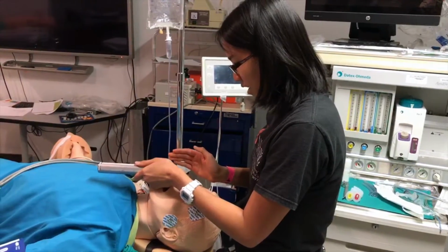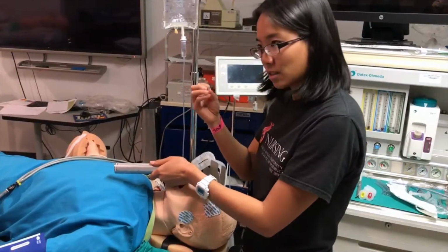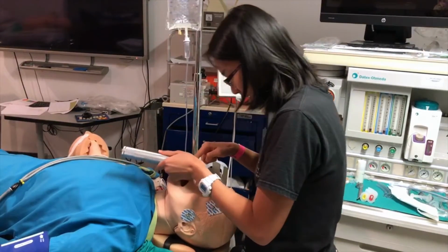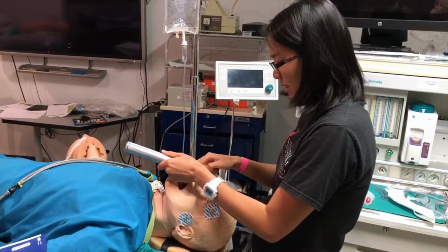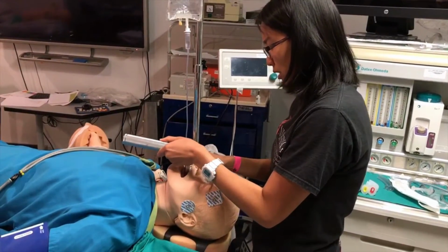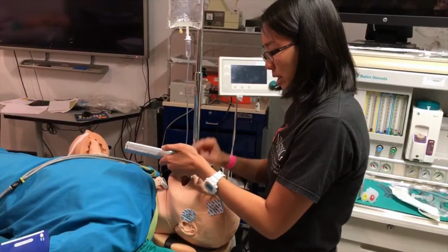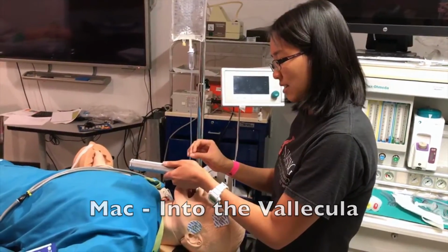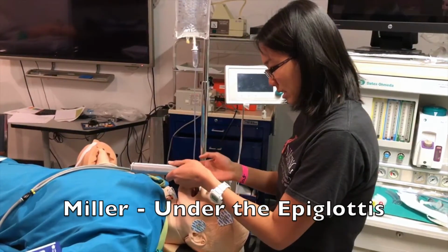Once you do that, you want to make sure to verbalize what you see. I see a hard palate, soft palate, uvula. I see the epiglottis. Once you see the epiglottis, depending on the blade you're using, I'm using a MAC blade right now, make sure you insert it in the right place. So the MAC would be in the valleculae and the Miller would be under the epiglottis.